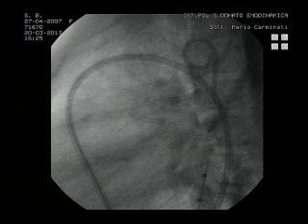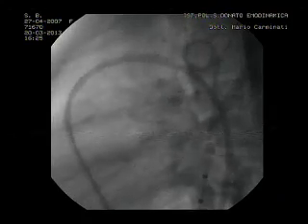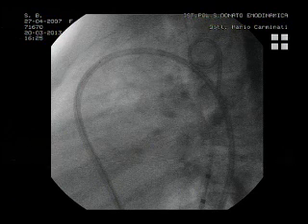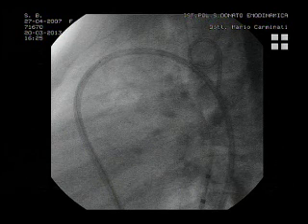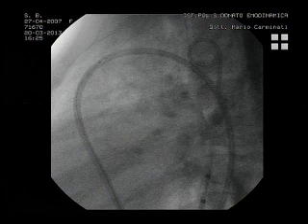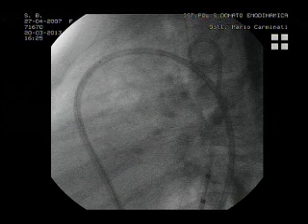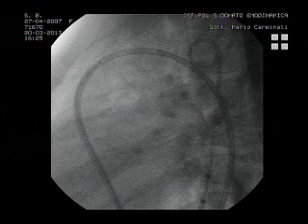Why not? Francisco is talking about the AVP2, the vascular plug 2, not the Amplatzer ductal occluder, but the vascular plug, the 3-segmented device. Well, I think the problem with the elongated ductus is that any device with a retention disc will be a weird configuration inside of the ampulla. So this kind of elongated ductus could be closed with a 6 or 8 millimeter AVP2.